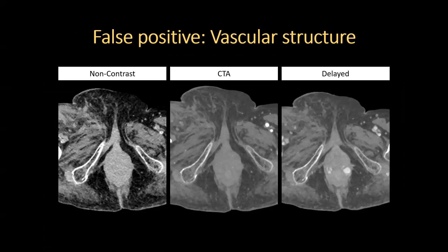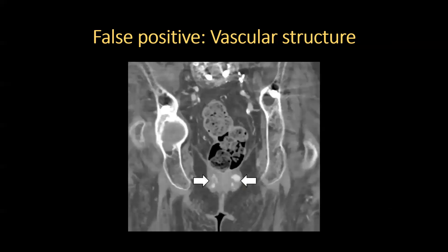In the same patient, active extravasation was also reported in the perineum, which would be unexpected since this area was not accessed. On non-contrast and arterial phase images, we see no extravasation of contrast material. On the delayed phase, there are lobulated contrast-filled structures surrounding the anus, consistent with hemorrhoids — dilated veins that you would expect to fill on a delayed phase. A coronal delayed phase image again confirms these are hemorrhoids and not active extravasation.